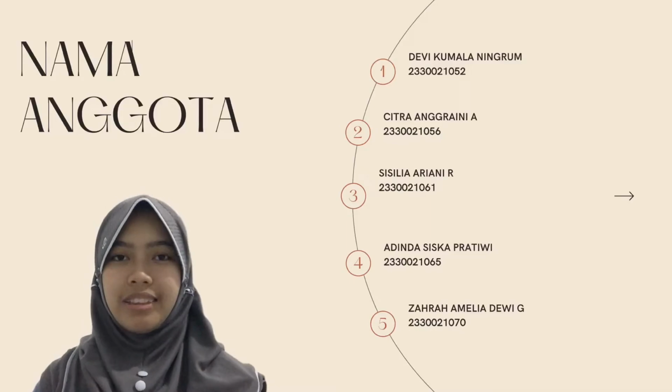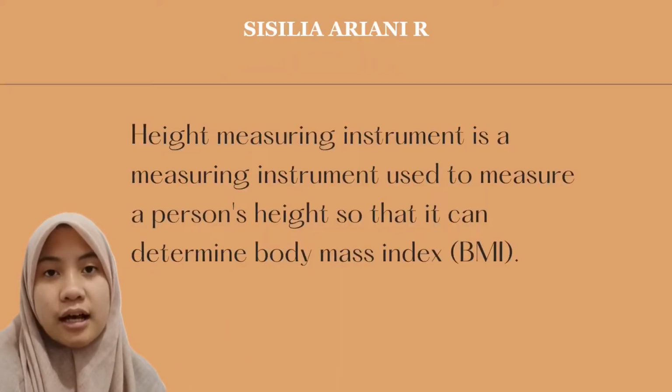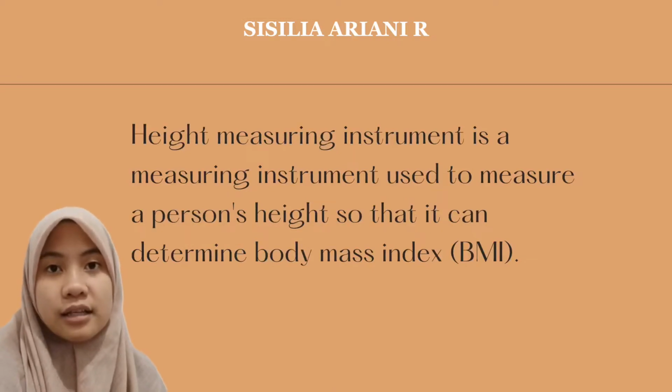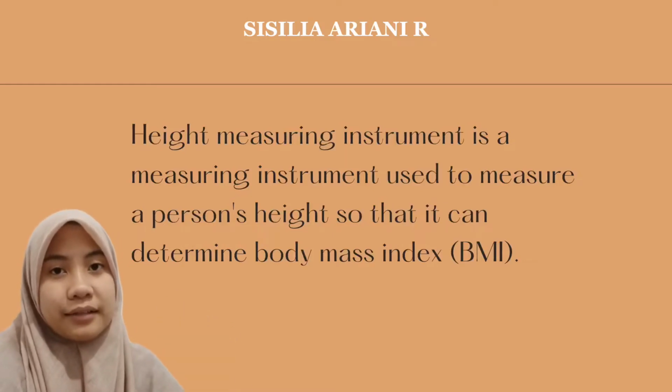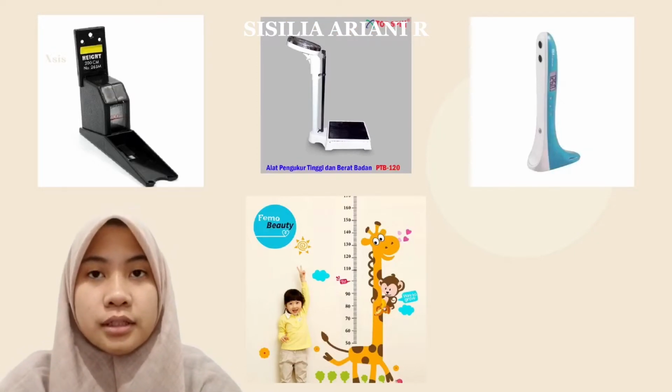Medical equipment and rooms in the hospital. Height measuring instrument. A height measuring instrument is a measuring instrument used to measure a person's height so that it can determine body mass index or BMI.